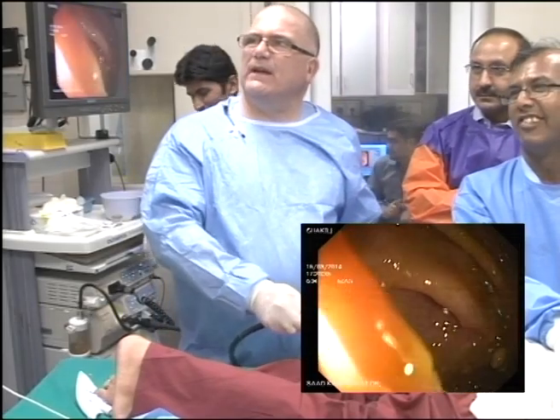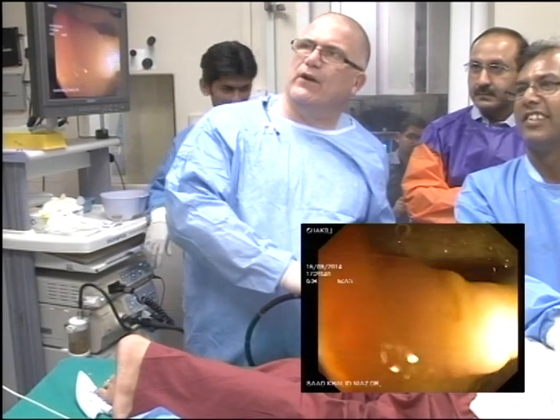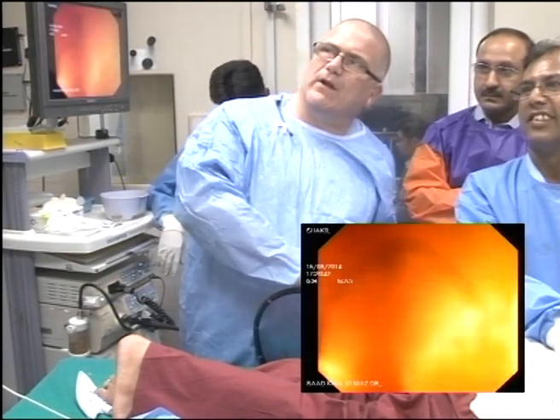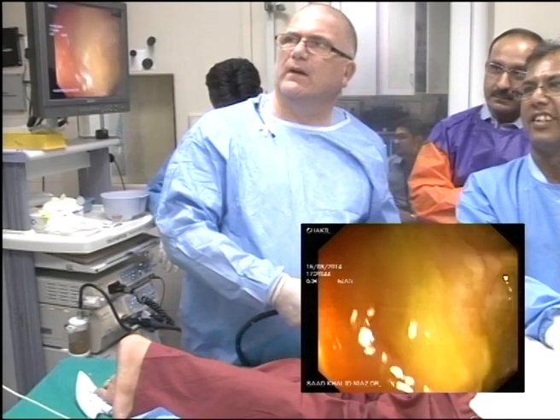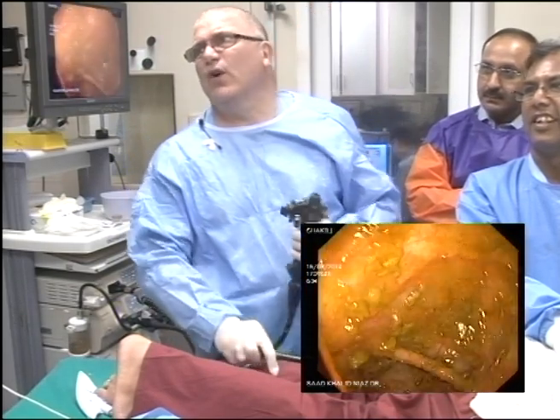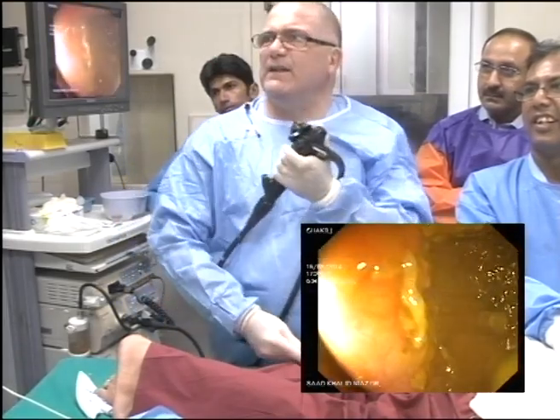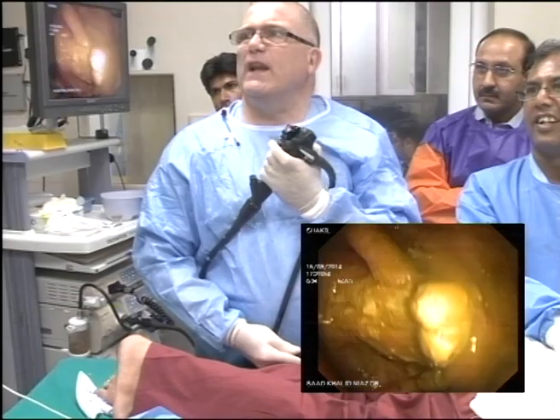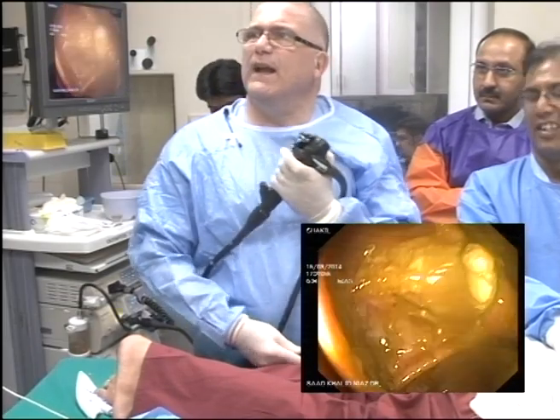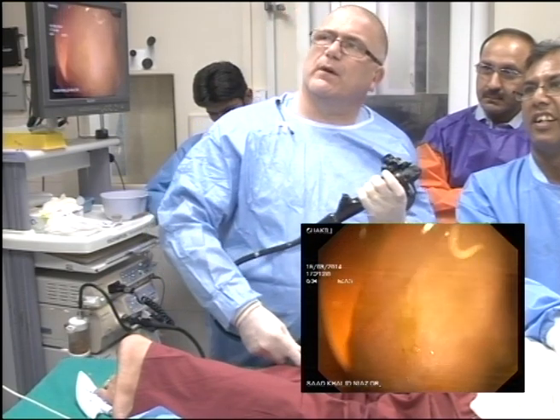So personally, the difficulty with this one is the fact that there was too much air early on, going in with too much clockwise torque initially, that does cause a lot of problems, in particular late on. What I'm showing you here is that you can actually torque the scope in any direction you wish, even in the cecum. That's what I was just showing you there.